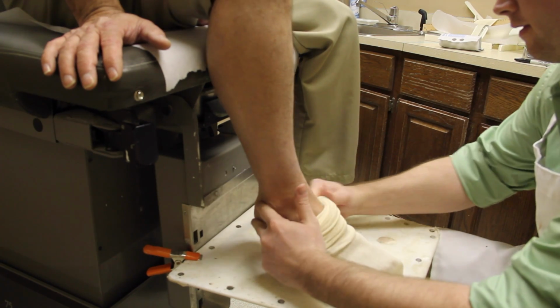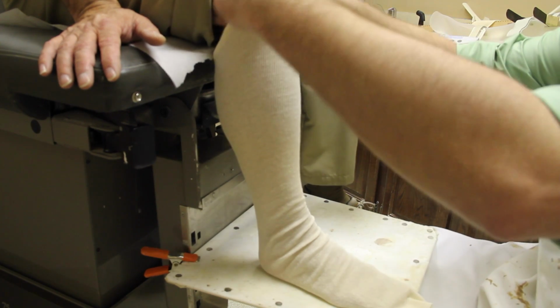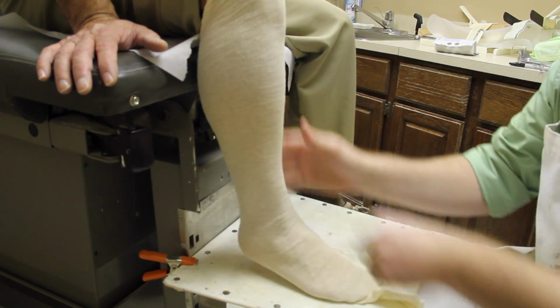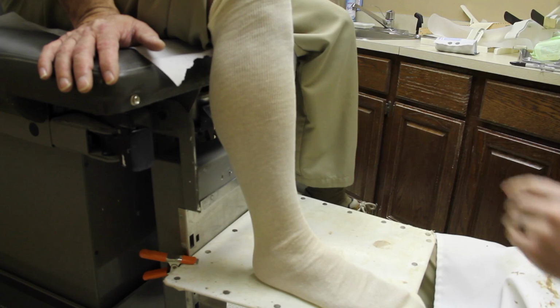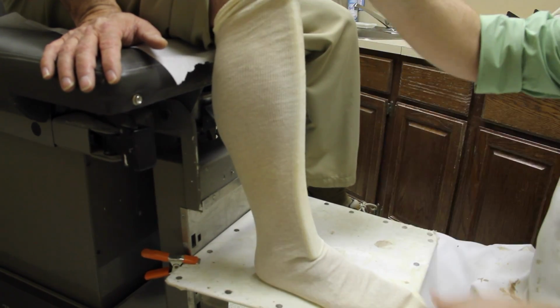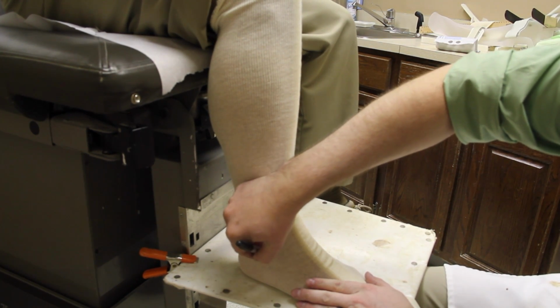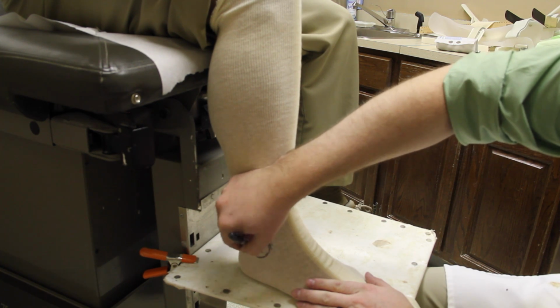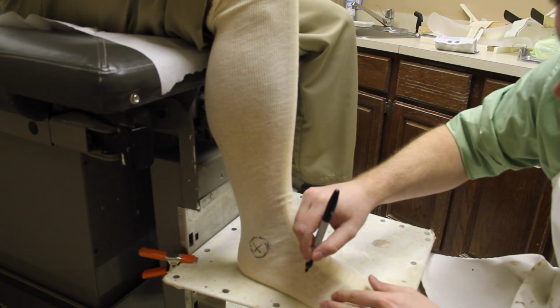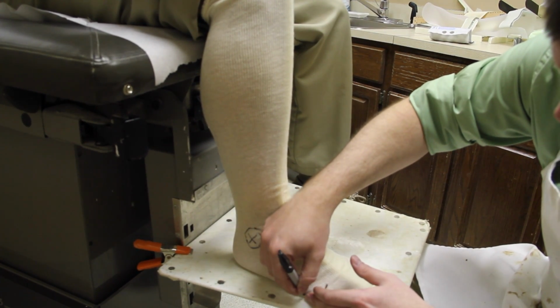So today we're going to start with just casting the AFO. We put a barrier on between the skin and the fiberglass that we're going to be using. We're going to mark both the medial and the lateral ankle. Later on we'll have to modify this out in the cast to try to build it up and give ourselves some room.